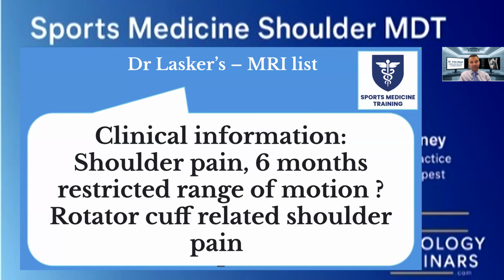So I didn't give you too much information, but that's usually what happens on a referral form. And as you probably identified, if you don't give much information, you're not going to get much back in the way of sensible diagnosis. So look, we've got a few questions here from the MDT, and a great way to learn is, when people start with MRI, often there's a hesitancy to get into MRI because it's really hard to get teaching. You might not know what's going on. You don't want to overcall stuff on a scan. So I've got a few questions for you.